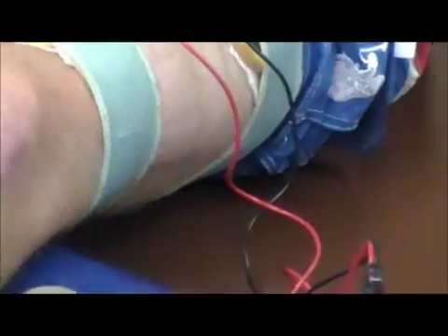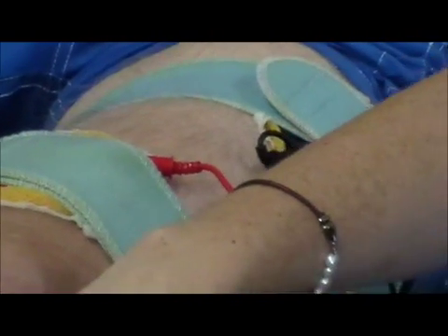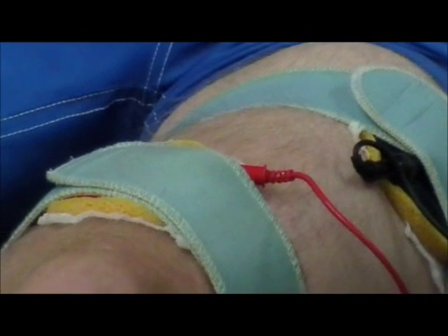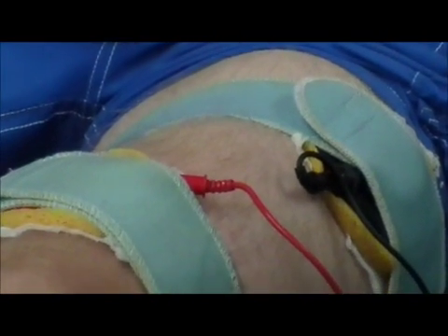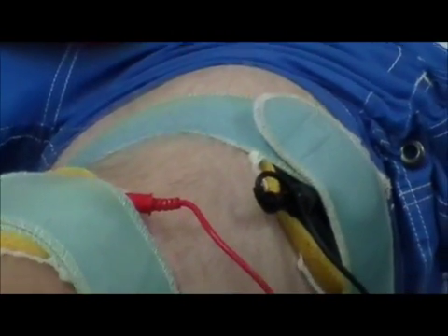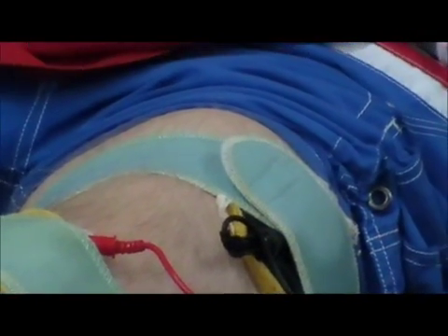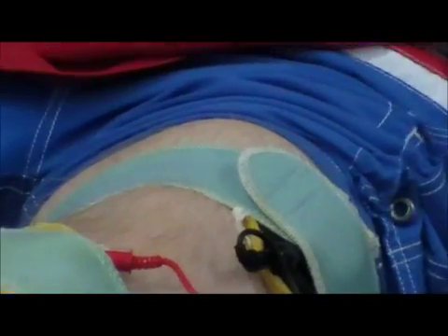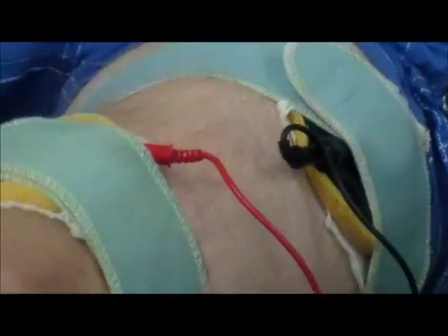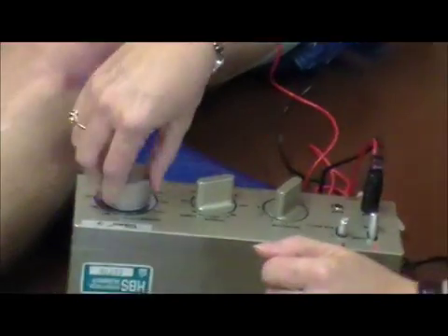Now 2, it'll... Okay? I don't know how you document that. Here we go, warm. That's really doing it. So you can see how that would pump for edema. As close as we're going to get for muscle pump. Okay. So now I'm going to turn it down.